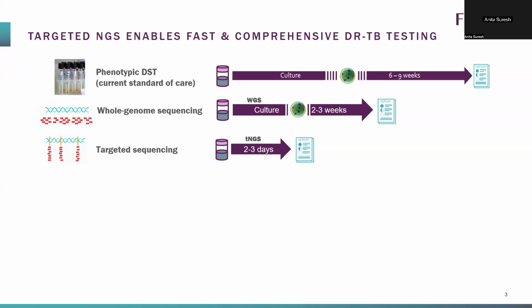all DNA in a sample of sputum, which is a typical sample for TB, you're going to get very little TB DNA when you use it directly and just do extraction from sputum. Therefore, when you're trying to do whole genome sequencing, you absolutely need a way to concentrate, enrich, or somehow focus only on the TB bug, which is why culture becomes a necessary step. This means you're adding 2 to 3 weeks to be able to get the result, which is why our focus about 4-5 years ago really was on targeted sequencing.